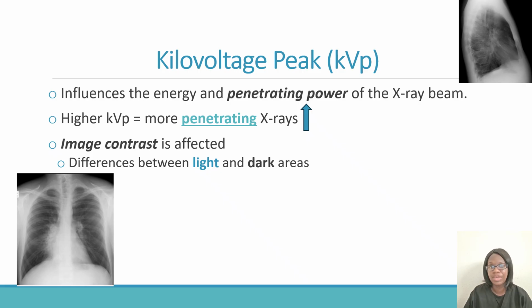We know hand, feet, and extremity X-rays are common. Abdomen X-rays are common. You can start by writing down the kVp and mAs ranges for those, and then get familiar with them, just in case your instructor comes to your clinical site and quizzes you on it.